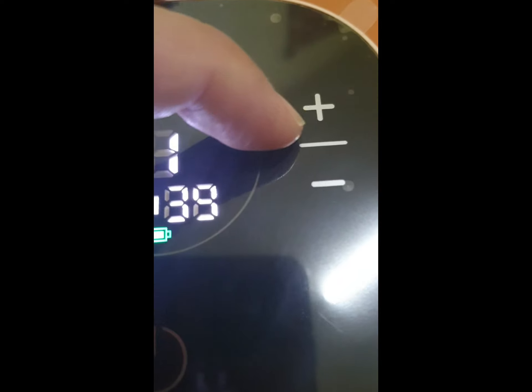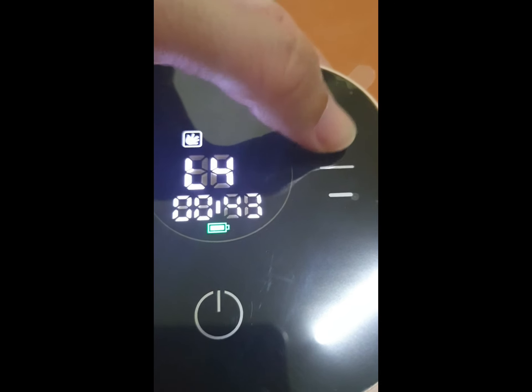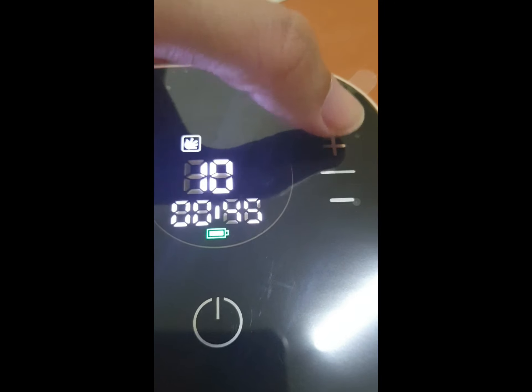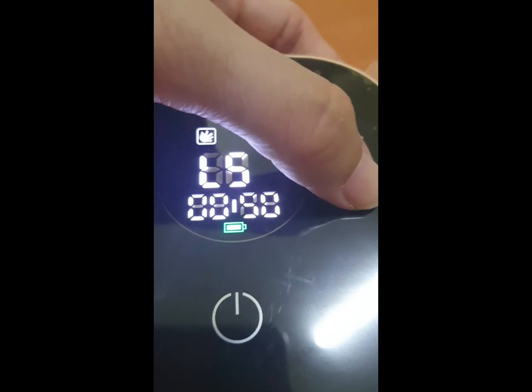This indicator is for massage mode, and the one here not yet lit is the expression mode. We have a pause and play button — this is the one you click to change from massage to expression or the bionic mode. We also have suction level control — for massage mode it goes up to level 10, and you can go back down to level one.